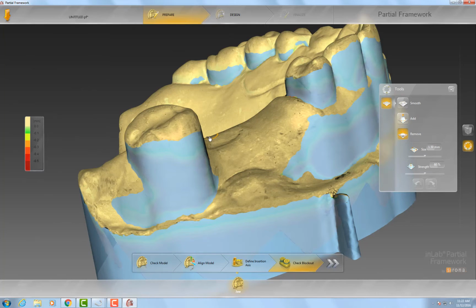Personally, I don't like to sweat, especially in the dental field. So if you start sweating when you seat these things, you should be able to make just a little bit more adjustments, and these should be seating in no longer than 10 minutes. We actually have it as a standard in our lab that these should seat in faster than 10 minutes. Anywhere from 5 to 10 is our benchmark.